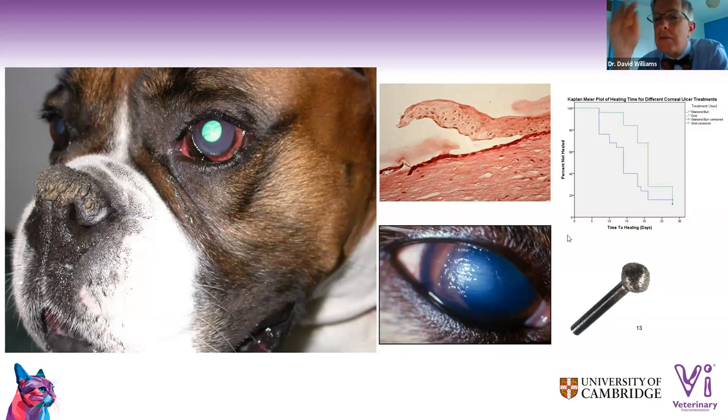removing the eye, I didn't put anything, no sponge or anything like that in there. Because if you close over the conjunctiva on either side, it's got a little drum there, and then close over the skin, over the surface, you don't need to put anything in, sponge or anything. The one or two cases I've had from other people who put those in are ones where it's got infected inside, so I prefer not to put anything in there at all.